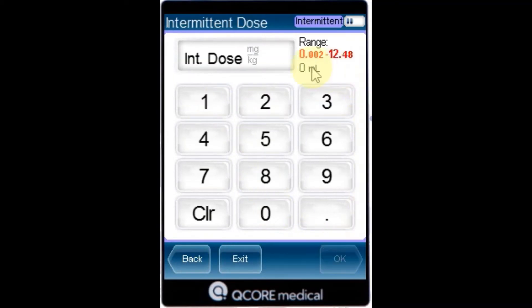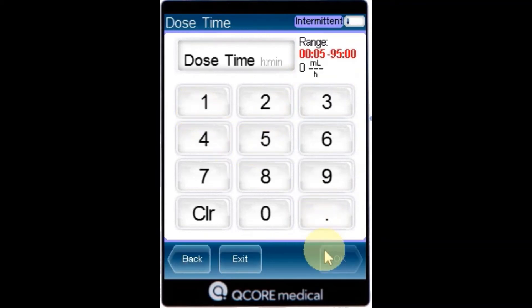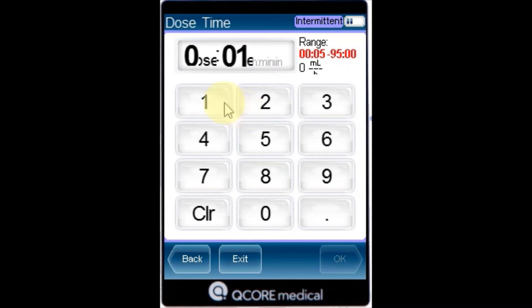Using the keypad, enter the intermittent dose, then press OK. Using the keypad, enter the dose time and press OK.